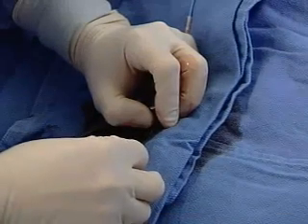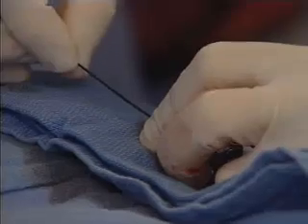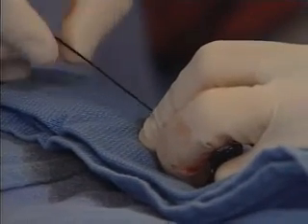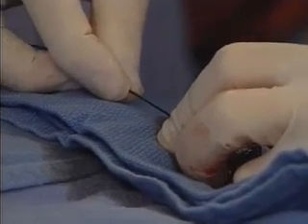And then Dr. Campbell is going to position this stent in the exact position to cover the blocked area, have one end of it in one of the more normal areas of the vessel, and the other end sitting in the other more normal area, and thereby get the whole vessel treated. There's the stent. You can see it's a pretty long stent by traditional standards. We don't worry as much about the length of the stent since that's not a big predictor of reblockage anymore with this device. And we have it there. That's a pretty good position.